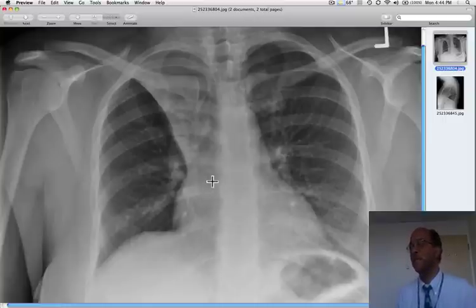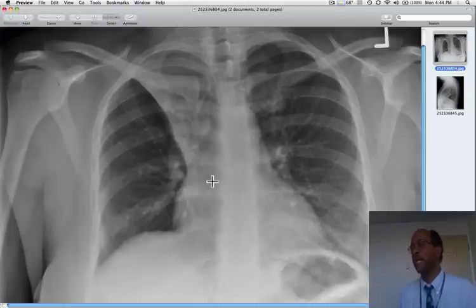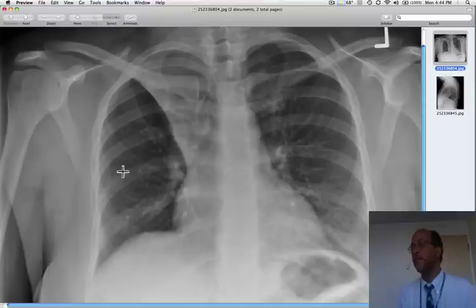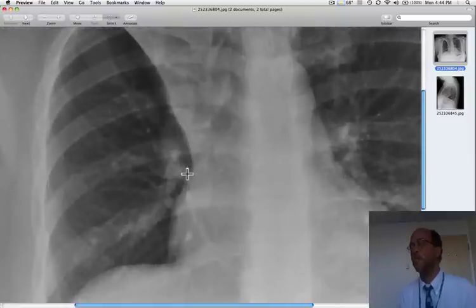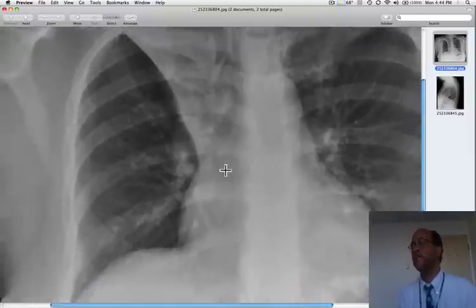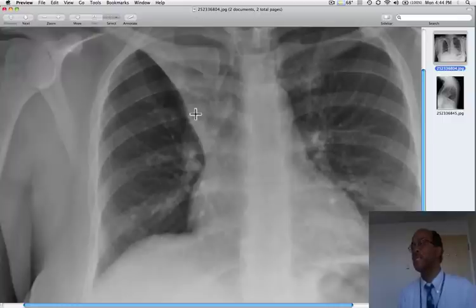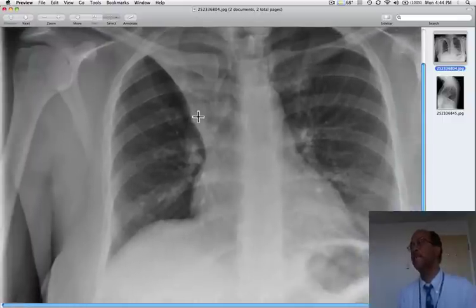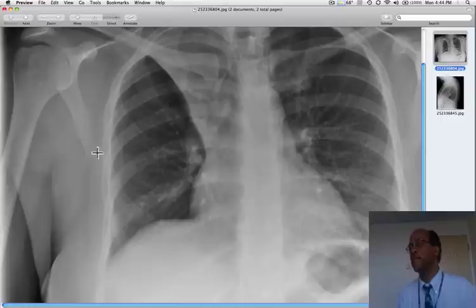The first thing to do is to look for direct evidence of lobar collapse, which is displacement of the fissure. So if I were able to identify a minor fissure in its normal location, then I would know this cannot be lobar collapse. However, we see that this must represent the elevated fissure because we no longer can identify it.